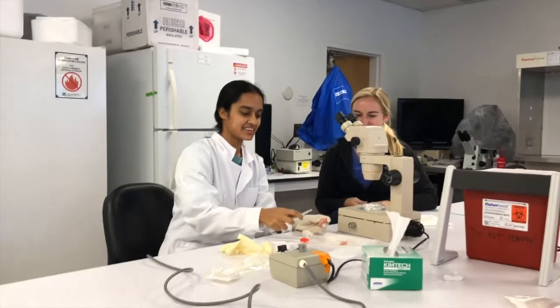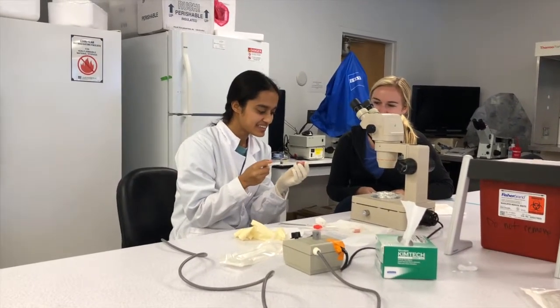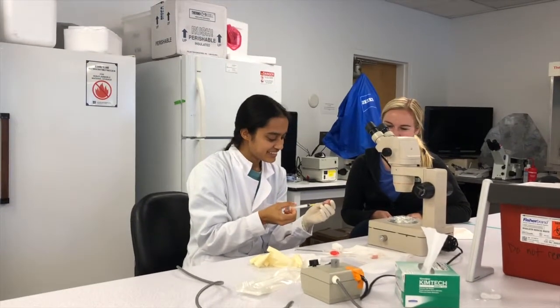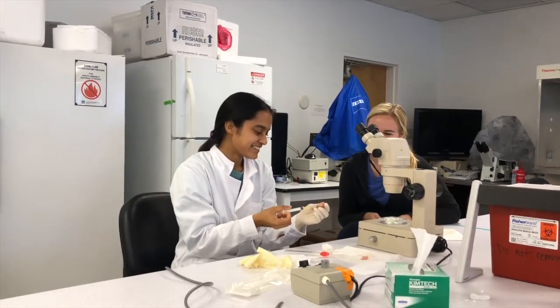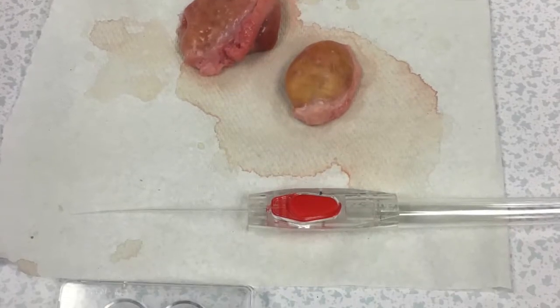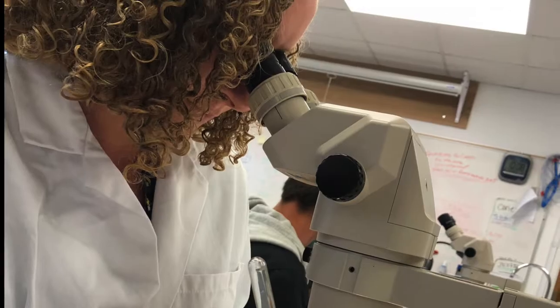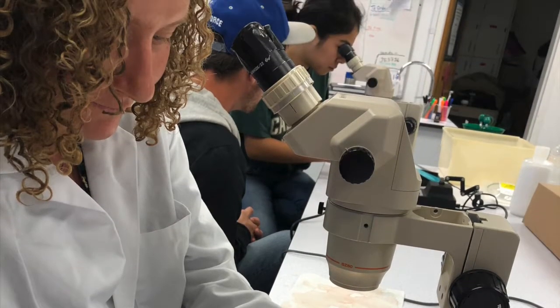Oocytes may be extracted using OPU in live donors or from removed ovaries post-mortem for the mass production of oocytes to be used in research or in the production of IVF embryos, or from genetically superior females. Once all tertiary follicles have been aspirated, oocytes are looked for in a search dish, and then moved through a series of wash wells to remove any pathogens such as BVD.